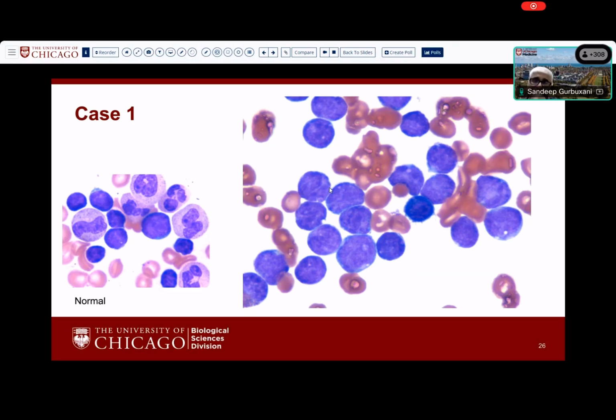And this happens to be an example of a hyperdiploid B-ALL, which means that you have trisomies of several chromosomes. In this particular case, they were for chromosome 4 and 10. And that's a common genetic subgroup that you see in the pediatric age group. More often than not, I see this morphology in association with a hyperdiploid B-ALL.